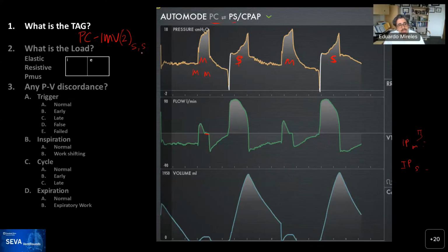You essentially set what you want, but the beauty of this mode, or the technology behind it, is that whenever the patient is breathing on their own, the patient will get spontaneous breaths. So essentially it eliminates issues with cycle synchrony in this group of patients. It goes away because of that.